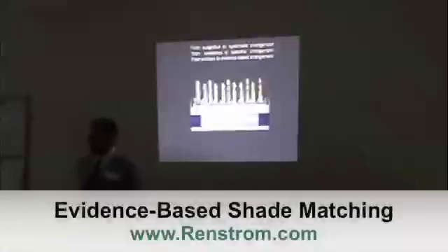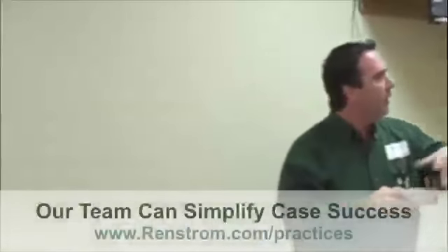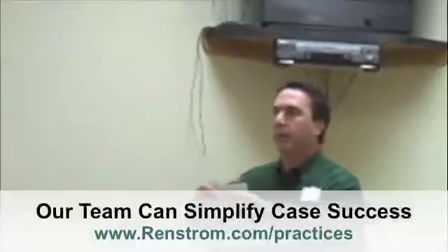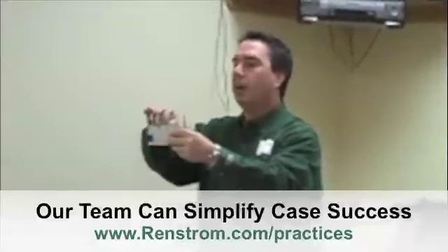3D, you should probably guess, is for the three dimensions of color: value, chroma, and hue. Let's make it scientifically based and evidence-based, as we've talked about. Literally, the number you give them tells the lab a lot. We've got different nomenclature here, but the first number is the value group. Remember, that's which one of these groups am I in? It could be 1, 1.5, 2, 2.5, 3, 3.5, 4, 4.5, 5.